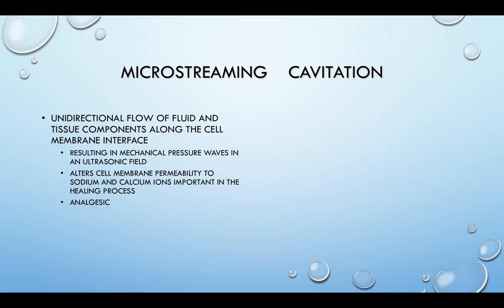This pressure, also think about it as sitting in a warm whirlpool, right? When you have the jets on you, it has this analgesic and pain decreasing effect. And so that unidirectional flow of fluid also helps with analgesia and helping with some pain relief.